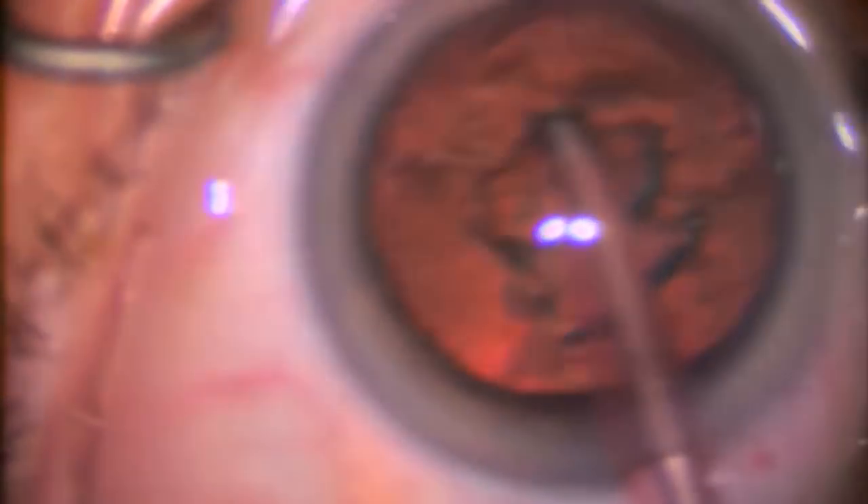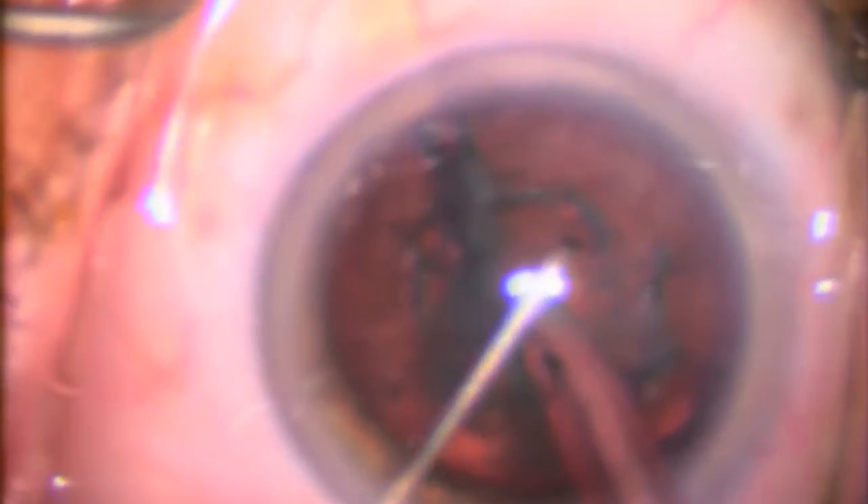Now we have a couple more videos to show how this technique works well on soft cases. Again, the anterior epinucleus is removed. We buzz in, and then the chopper is placed out over the nucleus, touching the tip of the chopper to the anterior nucleus. Then the two pieces are brought together. You do not need any vacuum for these soft ones, but they are often sticky, so you really want to spend some time pulling it apart so that you don't have any attachments that'll resist aspirating these pieces and bringing them out of the bag. Horizontal chop is a great technique for soft lenses, even down to trace nuclear sclerotic cataracts — you can typically slice them all the way up to 4-plus NSCs. It's a very versatile technique. The chopper is a great lens rotator as well. Since it's sticky, really focus on separating.